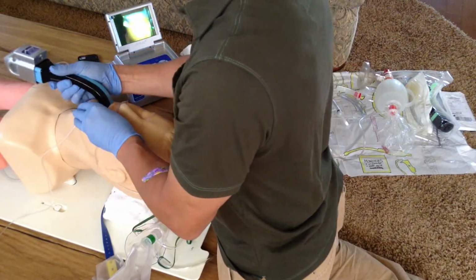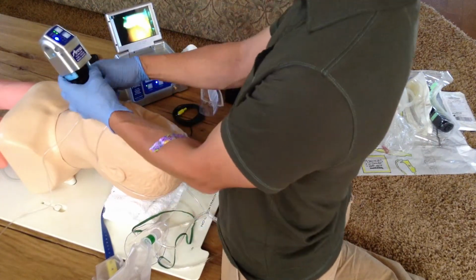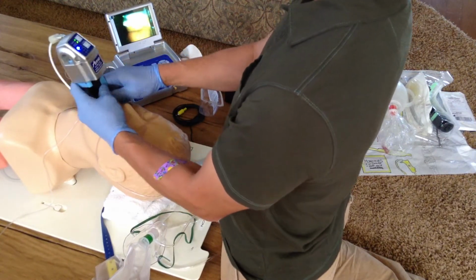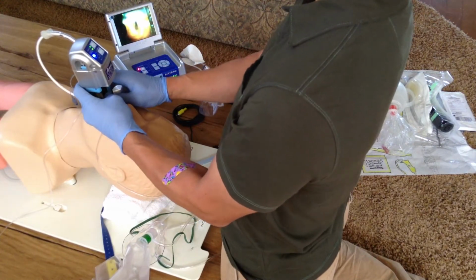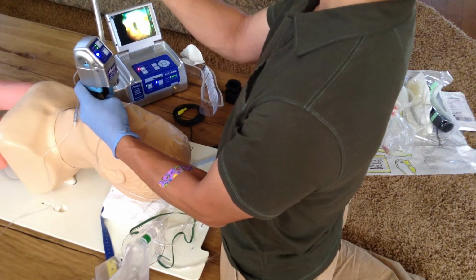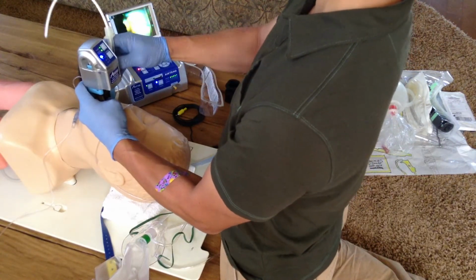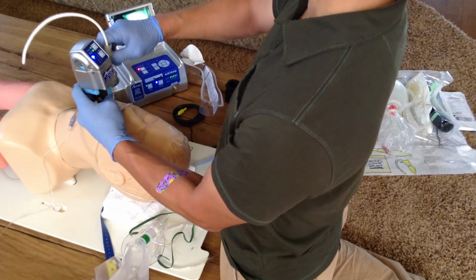Watch it go in to the posterior tongue, then watch your monitor, follow the posterior tongue, pulling the Airtraq up. Progressive epiglottoscopy, there's the epiglottis. You can go into the vallecula, you see the cords. You could advance this first, or if it looks like it's an easy shot, just go straight ahead. Sometimes if it sticks, a little bit of a left turn might get it in there.